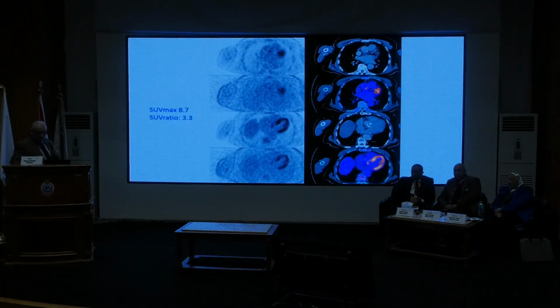This is a patient who came to us last week. This is one of our cases, complaining of fever of unknown origin. He was not referred as suspected for infective endocarditis. He was referred for fever of unknown origin. So as you can see, he was not properly prepared. There is a lot of cardiac uptake because he was fasting only for 6 hours.